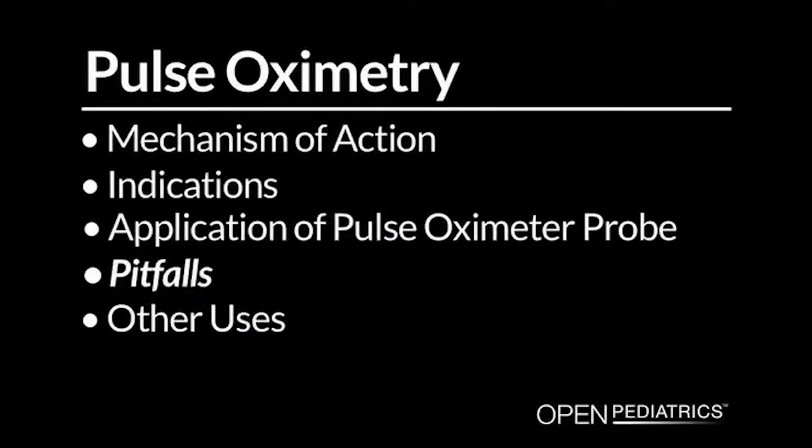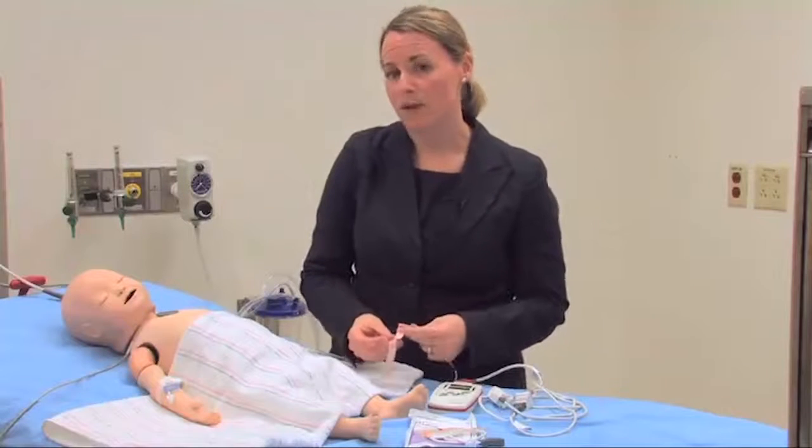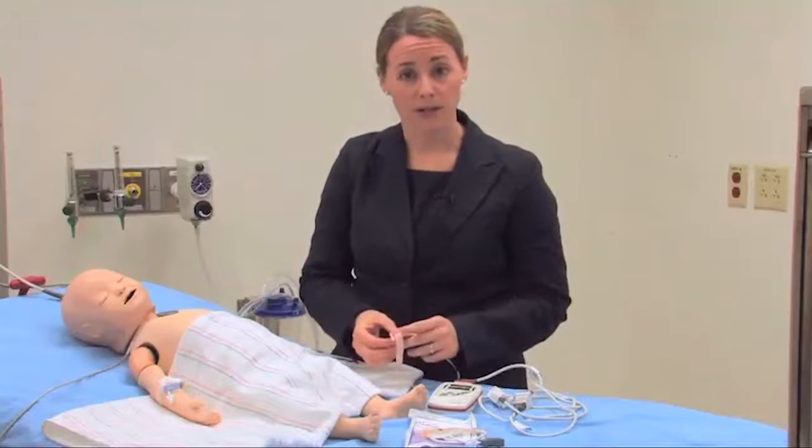Pitfalls. So now I'm just going to demonstrate some of the pitfalls you might experience when using pulse oximetry.